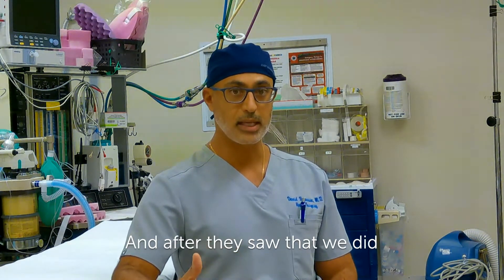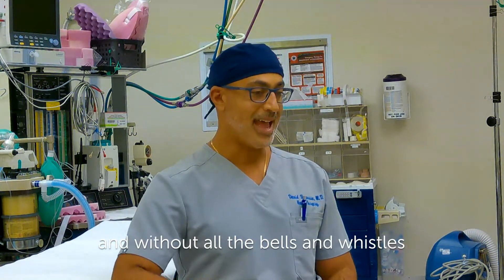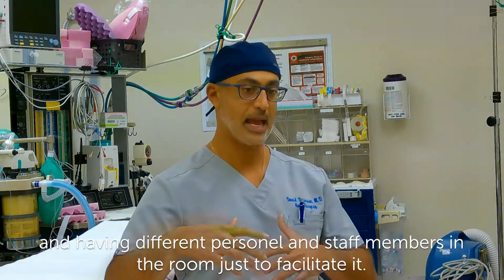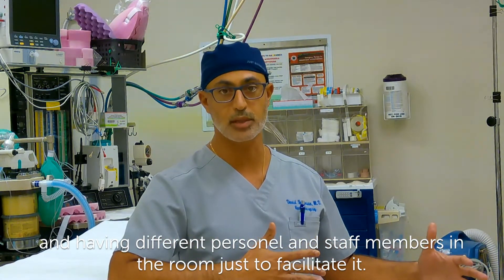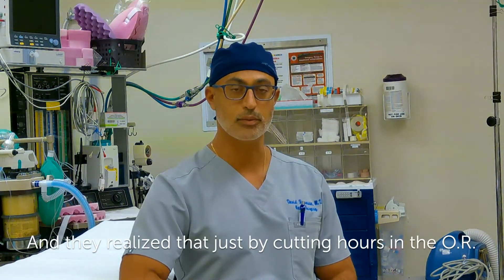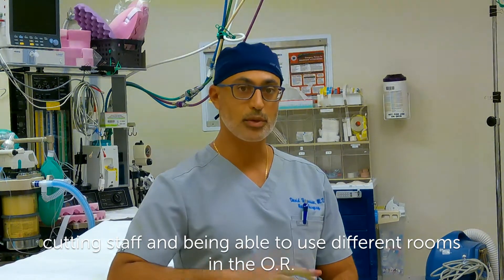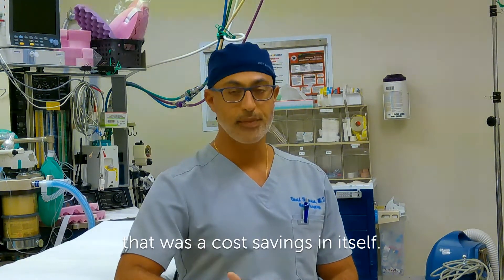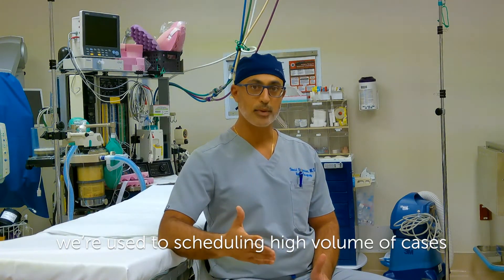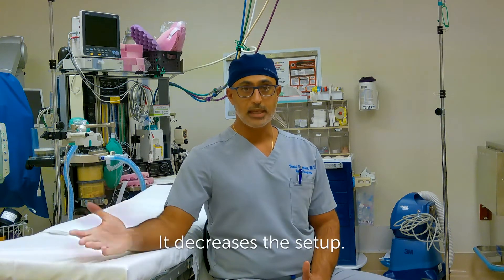After they saw that we did an endoscopic carpal tunnel release with a two to three minute tourniquet time, and without all the bells and whistles that go to setting up a tower and having different personnel and staff members in the room just to facilitate it, for them it was a no-brainer. They realized that just by cutting hours in the OR, cutting staff, and being able to use different rooms in the OR, that was a cost savings in itself. As hand surgeons, we're used to scheduling high volume of cases and just bouncing from room to room.